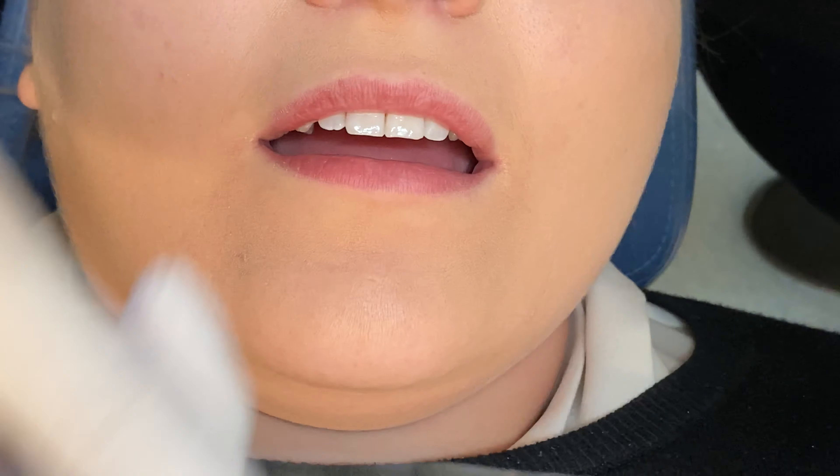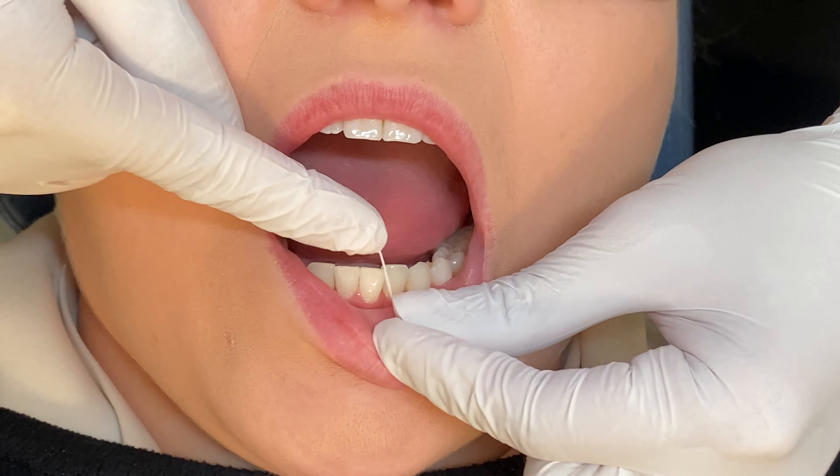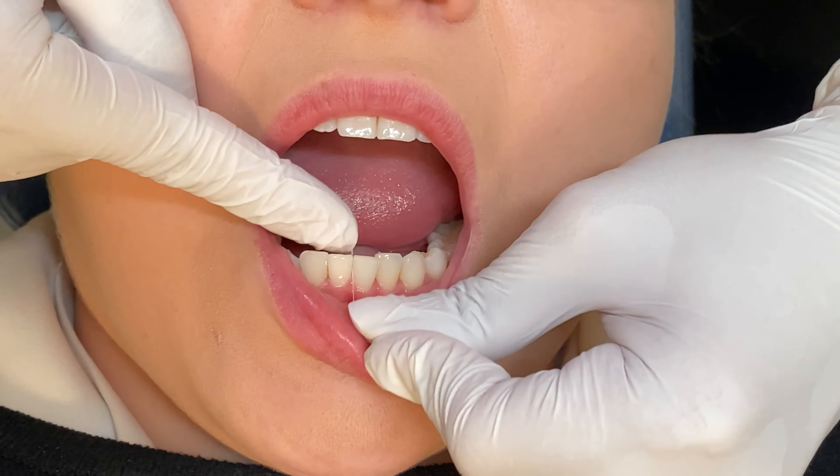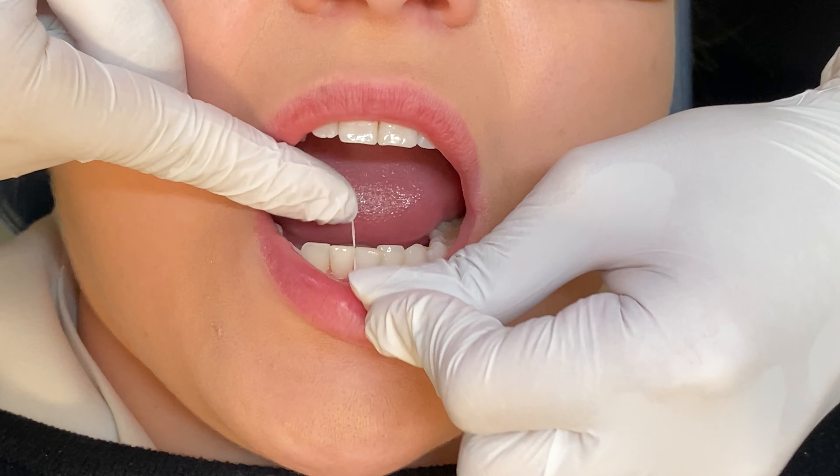First, check all contacts with floss. Contacts are the area where two teeth touch each other. You need to feel and listen for a click or any tightness between the teeth. If you feel resistance with the floss, there is a binding contact.